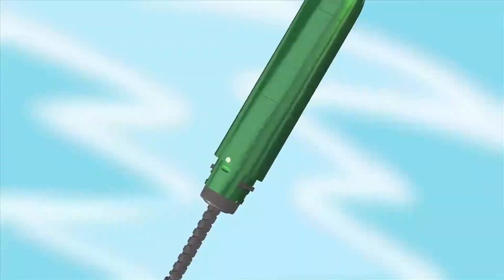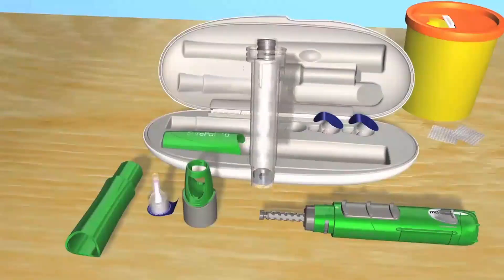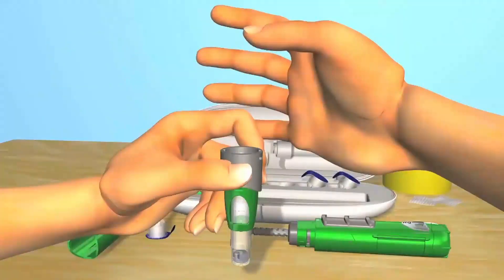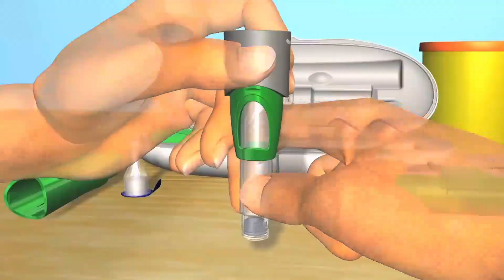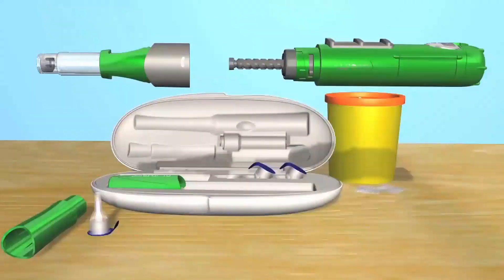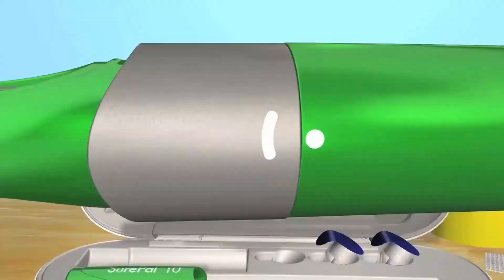Now that the dose is set, it's time to load a preassembled cartridge. Pick up the preassembled cartridge and the locking ring, and drop the preassembled cartridge with the small side down into the ring. Holding the bottom of the cartridge, rotate it gently until it drops down into the locking ring and doesn't twist anymore, then pull it gently until you hear or feel it click into place. Hold the locking ring in one hand and pick up your SurePal with the other, then screw the locking ring with preassembled cartridge onto the SurePal body. Make sure the half circle on the locking ring and the dot on the SurePal body line up.